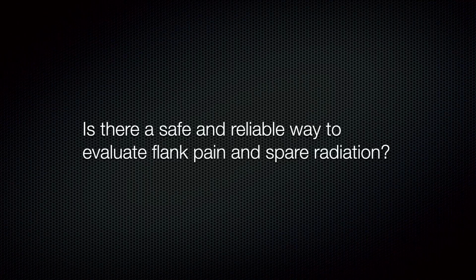And that really brings us to the second part of our conversation here, where we look into some literature and see what we can do with some clinical decision tools and what we can do with some ultrasound to really put a dent in those numbers and come up with a very pragmatic pathway of how we manage these patients in the ED, right?